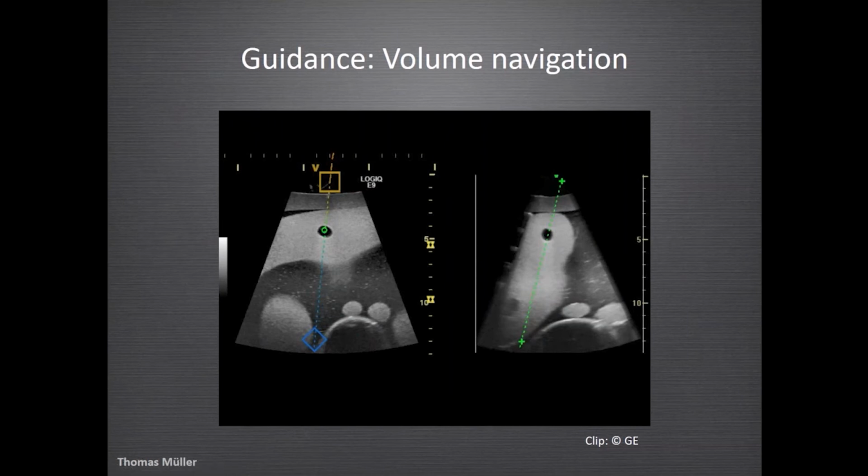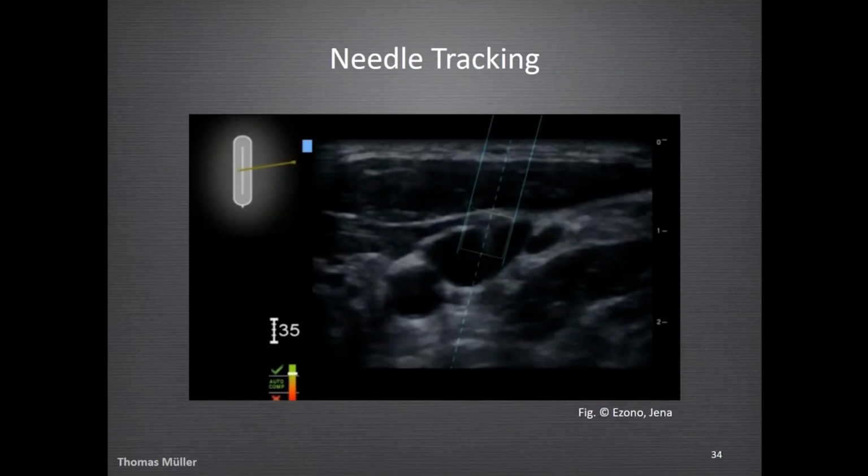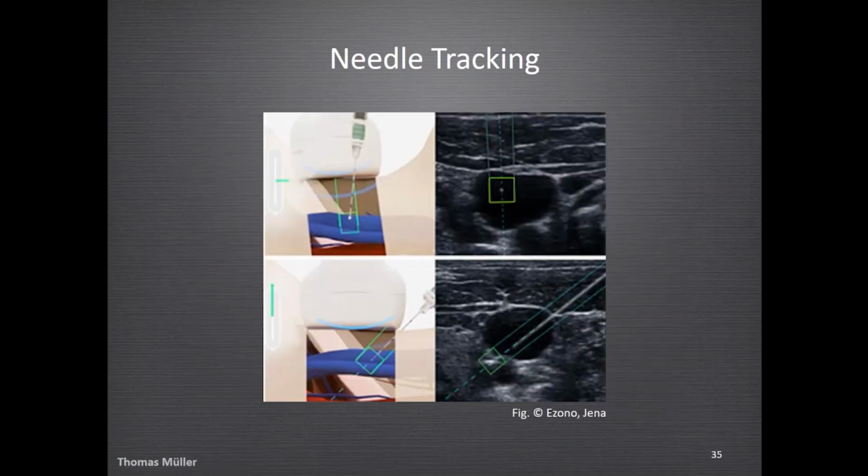I don't use it because, to tell you the truth, we don't have the time and the money to always prepare patients for that. Needle tracking can be done electromagnetically, like here, an image I got from eZono, where the needle is tracked by electromagnetic radiation. So you can see here you have that artificial visualization of your needle trajectory on the image, which will help you to get your needle into your target.